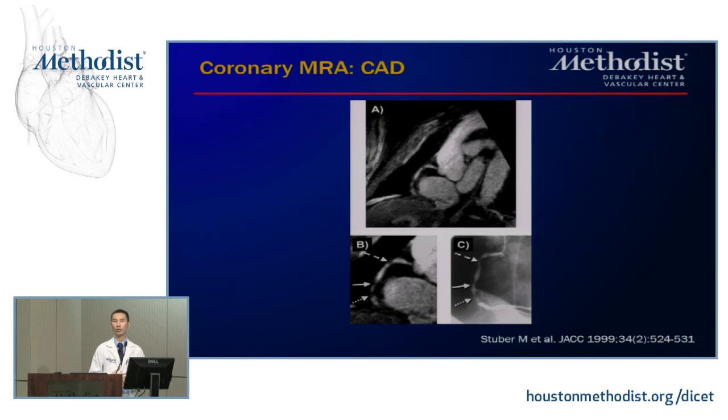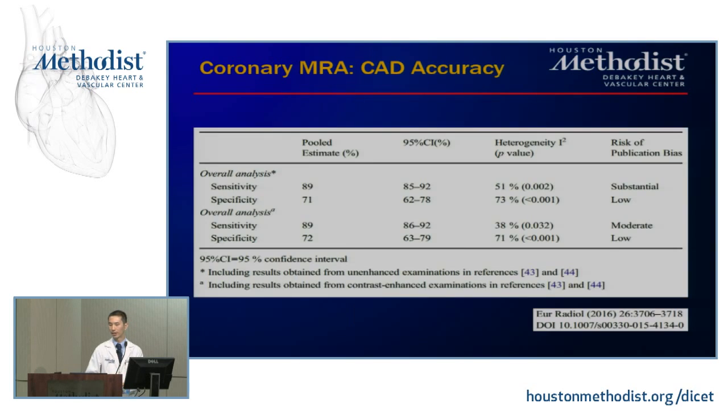So if I had a choice between picking cardiac CT versus coronary CMR, I would rather pick cardiac CT instead. Okay. This was a study done recently showing the sensitivity and specificity of detecting CAD lesions by coronary MRI. And here the data look pretty good, but then again, if you have good data and you publish it, then you tend to have a little publication bias with that.